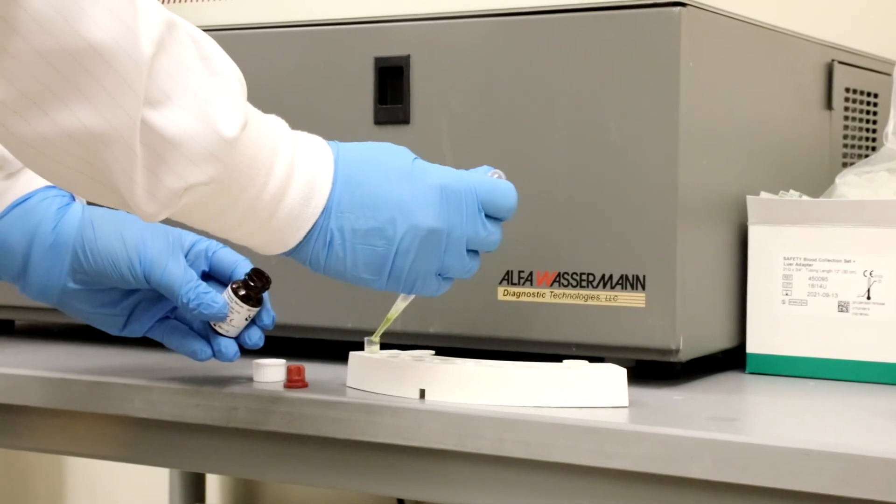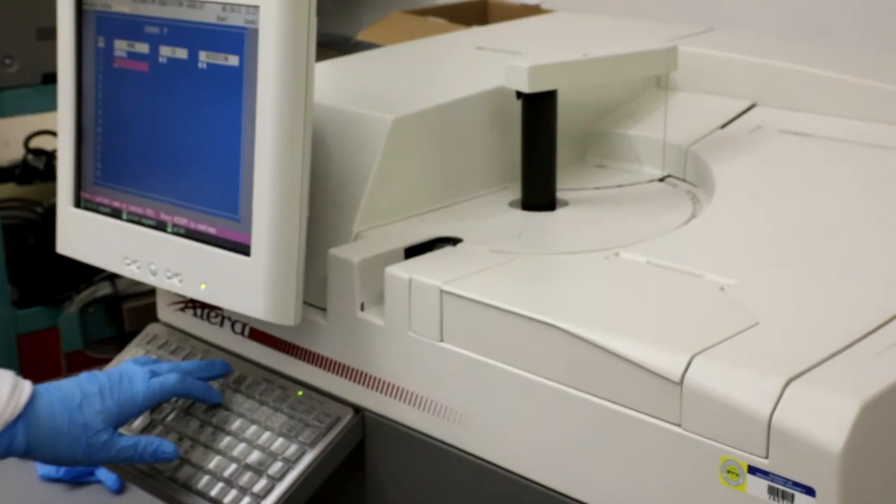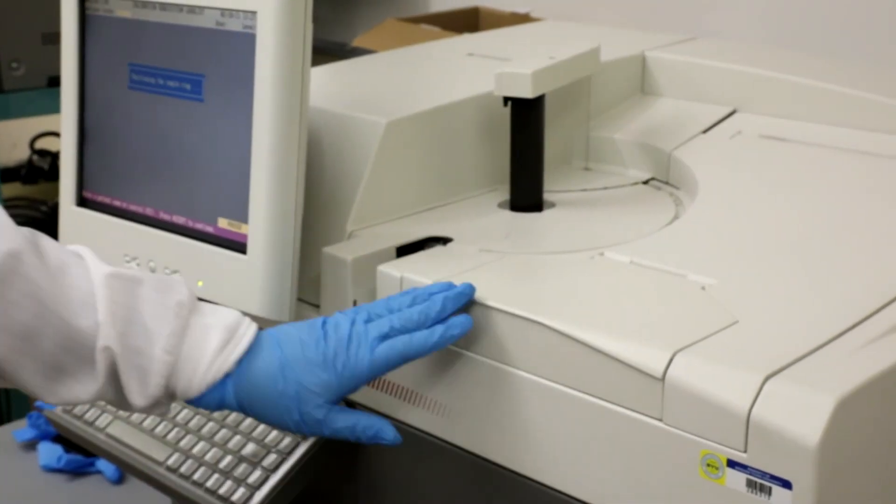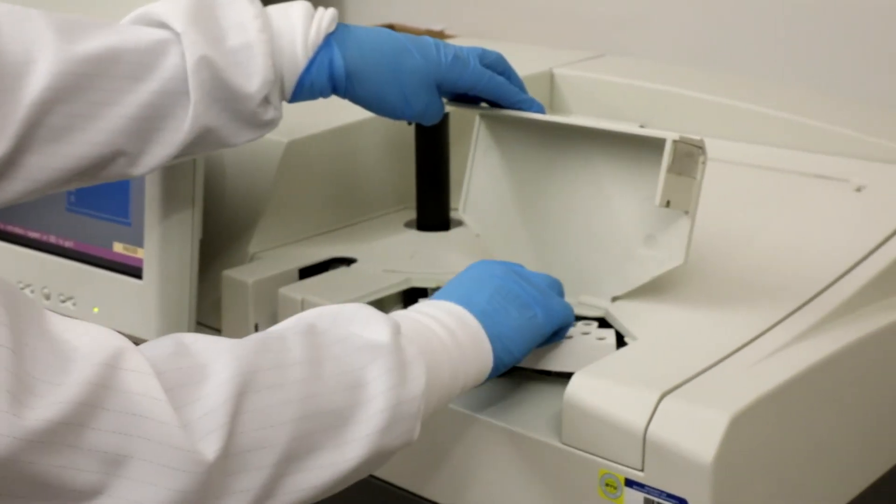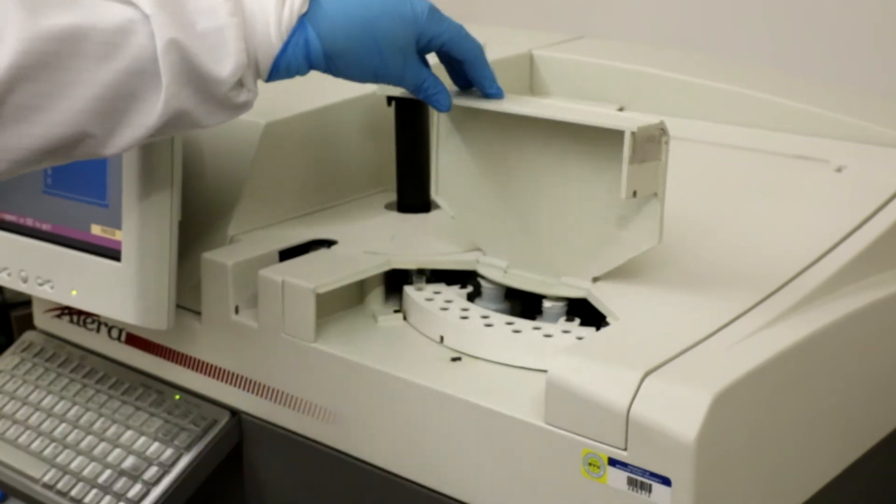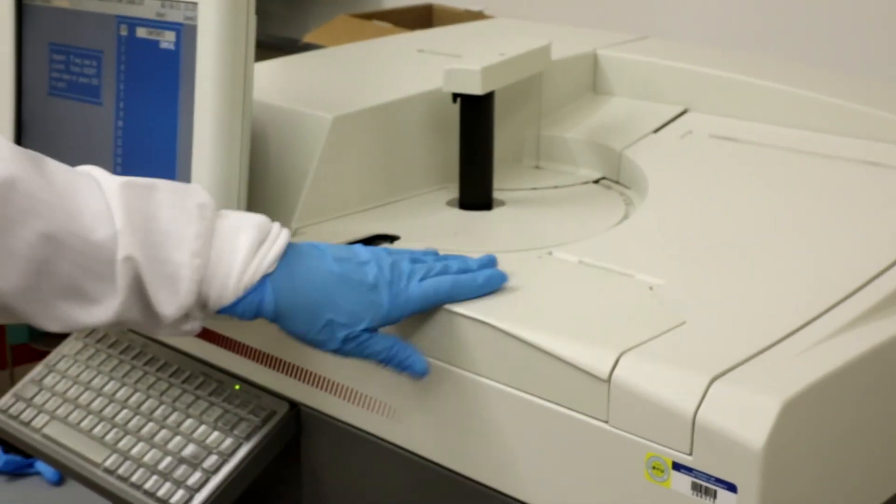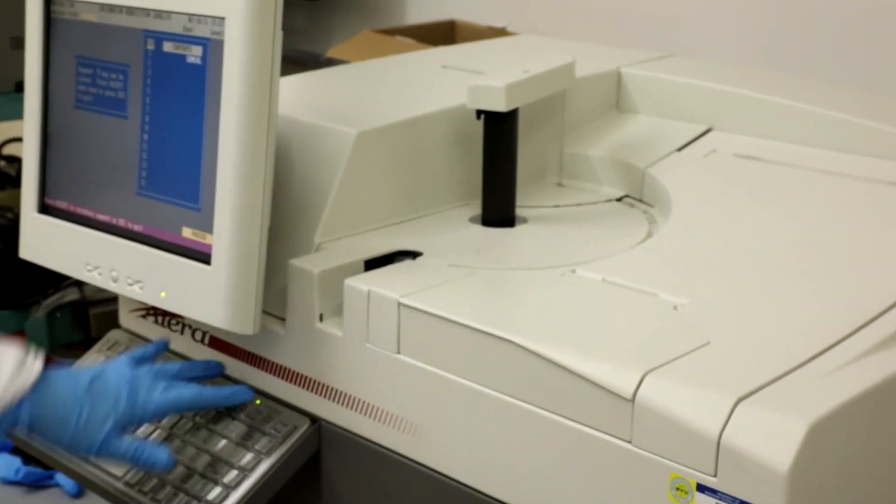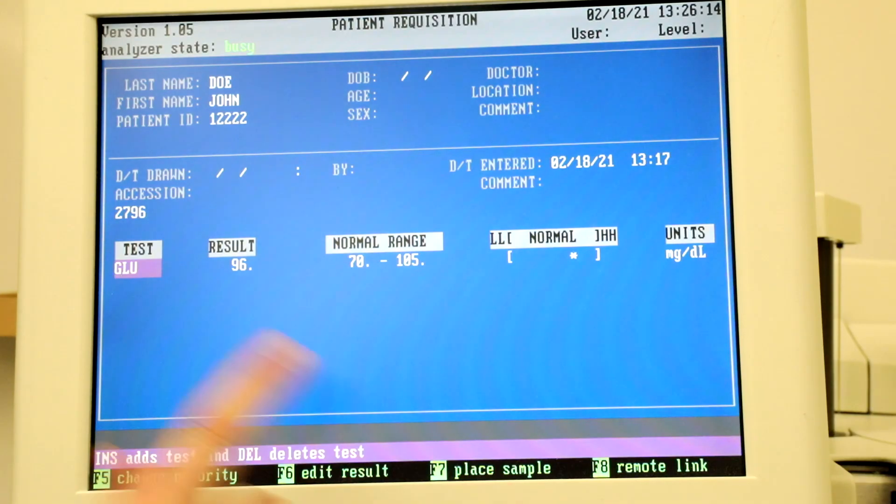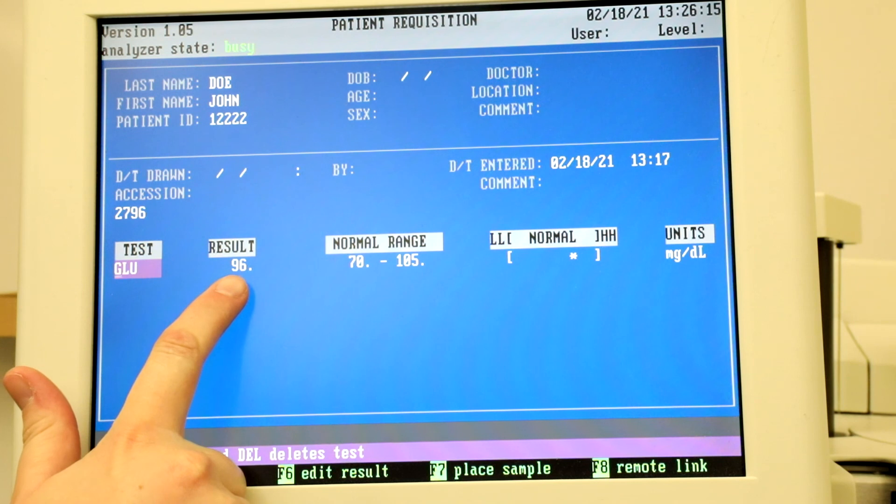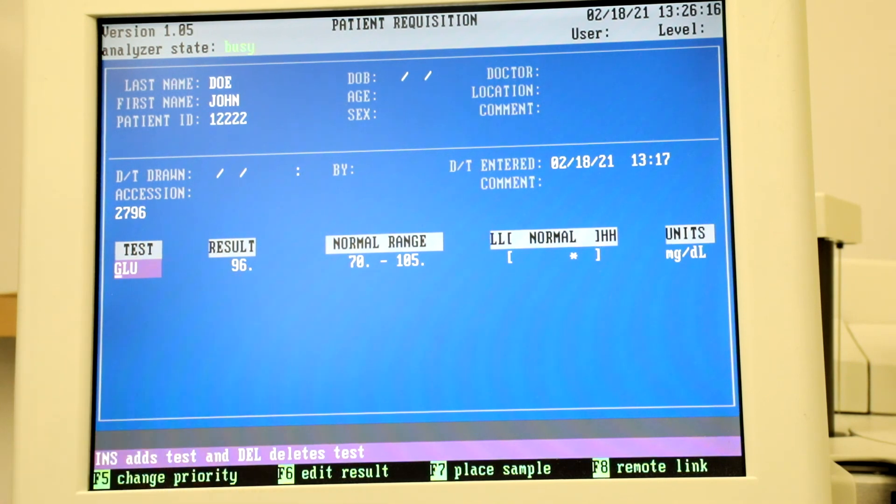Then hit F7 to place the segment on the instrument. If calibration fails, an attention box will pop up. If calibration passes, you will be able to then run QC.